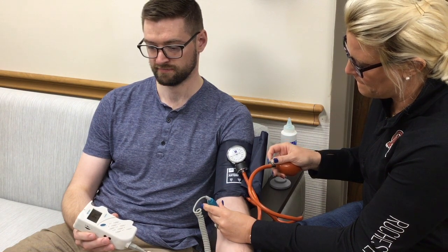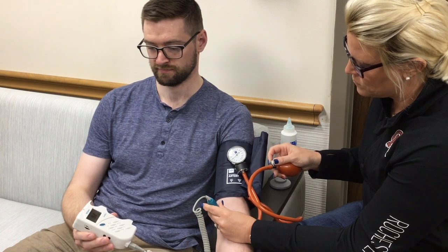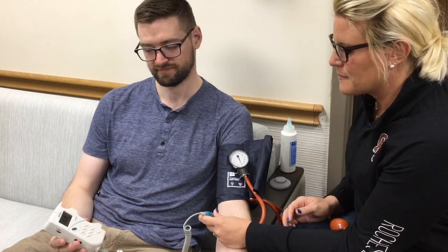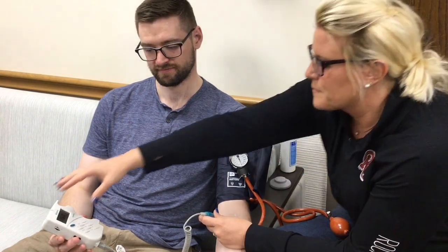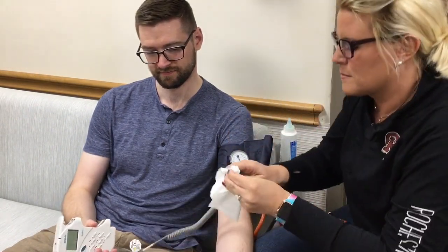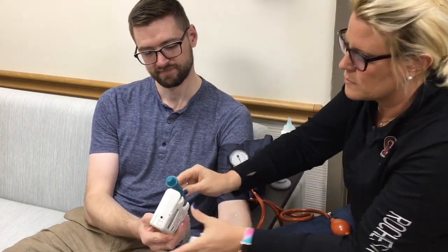When you hear the pulse return, this number is your blood pressure. In LVAD patients, this number represents the mean arterial pressure or MAP. All that is left to do is to turn off the Doppler, remove the cuff, and wipe the gel off their arm and the Doppler wand.